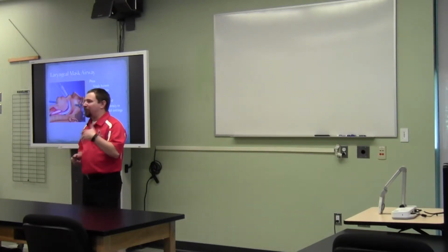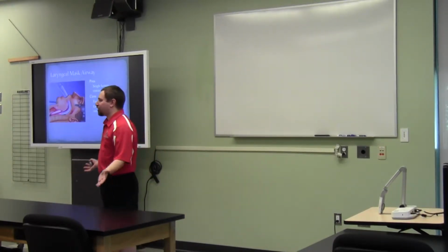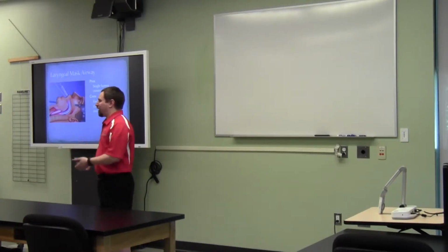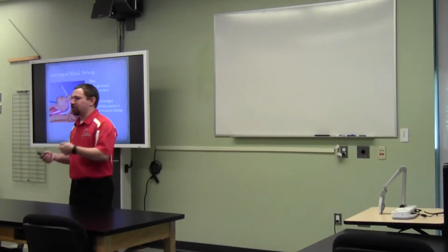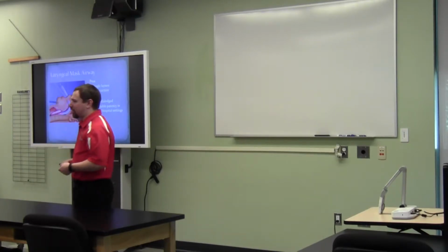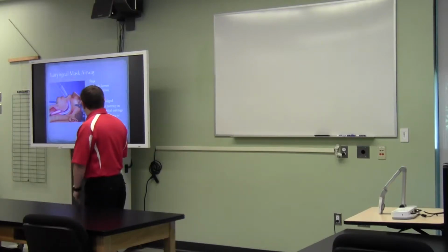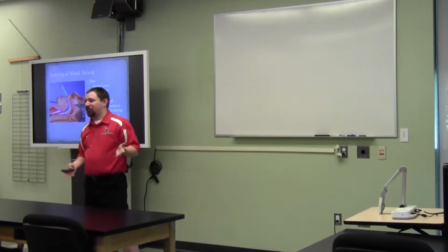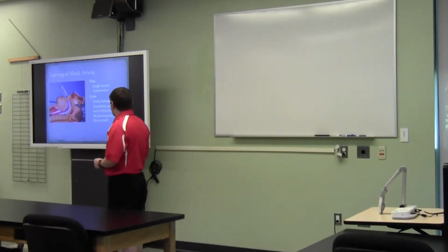They had unreliable patency because guess what? They're not a patient who's just lying there getting a procedure in a surgery bay. We have patients that we're going to have to pick up and move. And we're going to have to go upstairs, downstairs, and transfer from ground to stretcher to hospital gurney, and later on, these things came loose. They didn't have any way to decompress the stomach or do anything for the stomach because once again, they're designed for somebody who hasn't eaten in the last 12 hours.